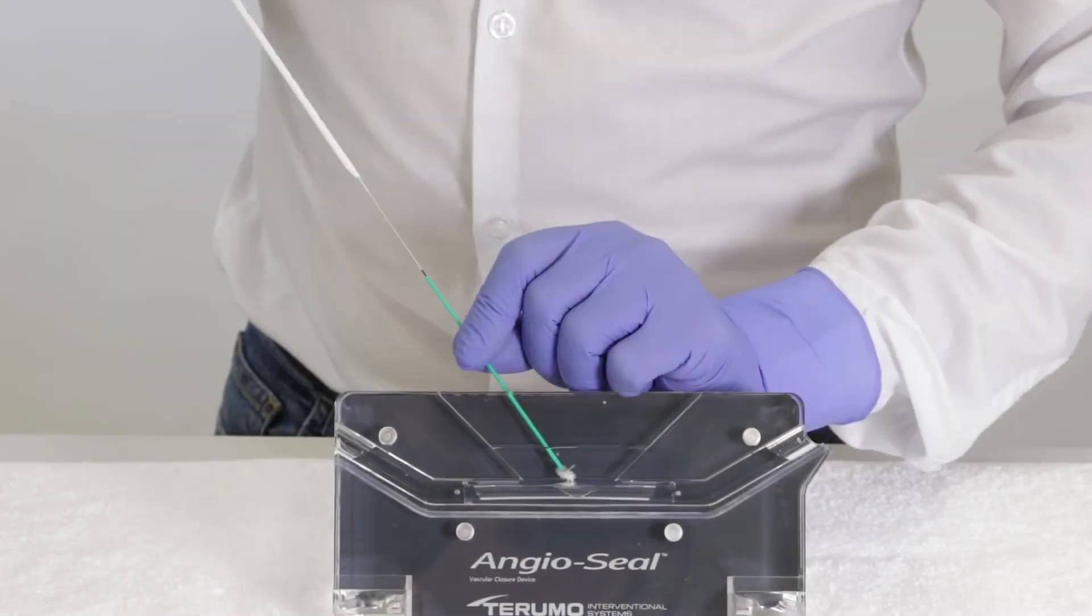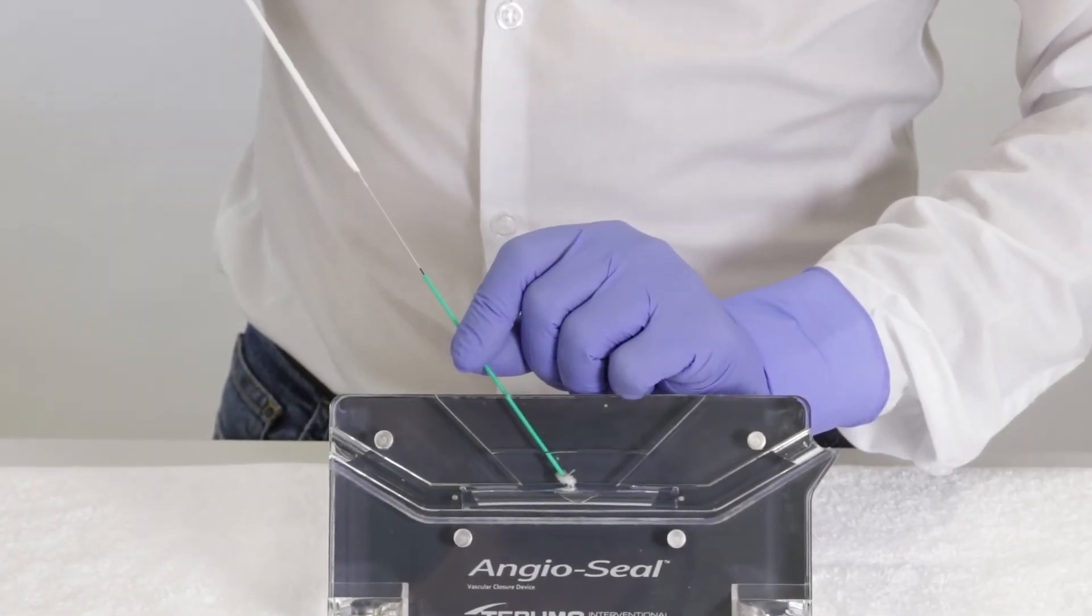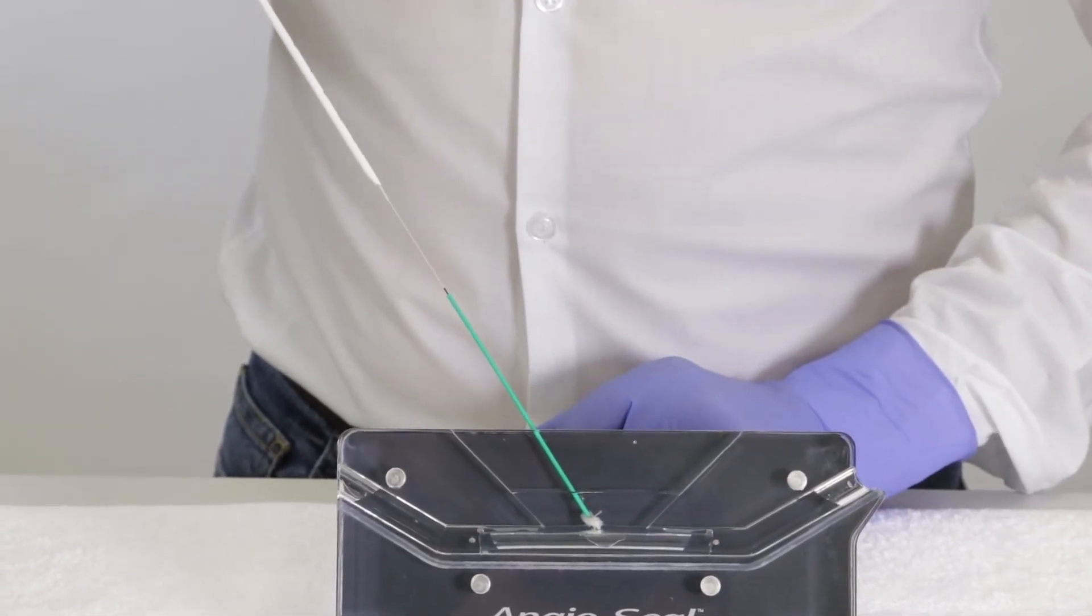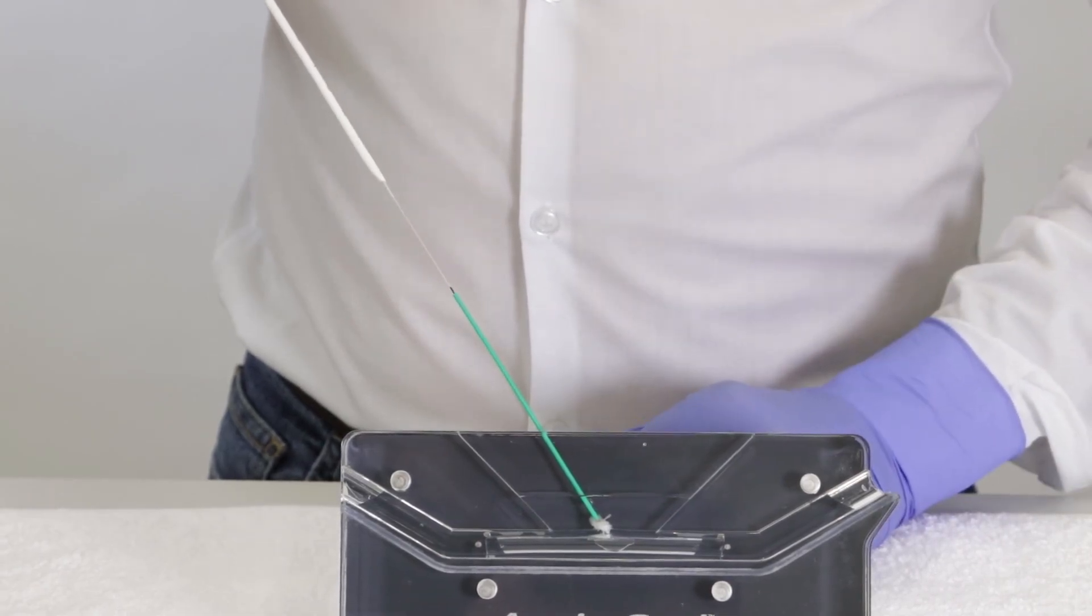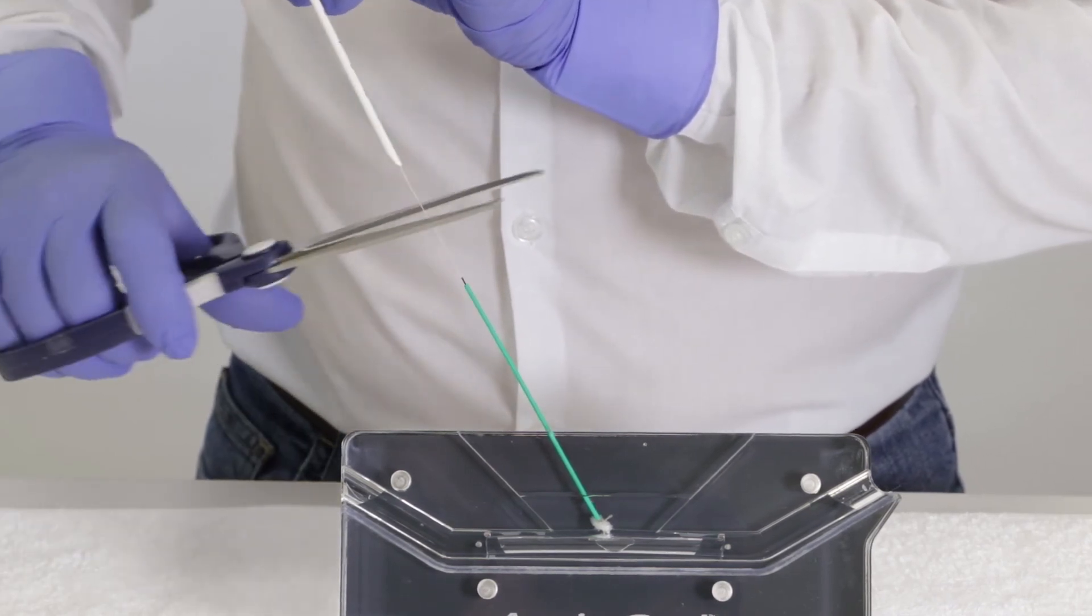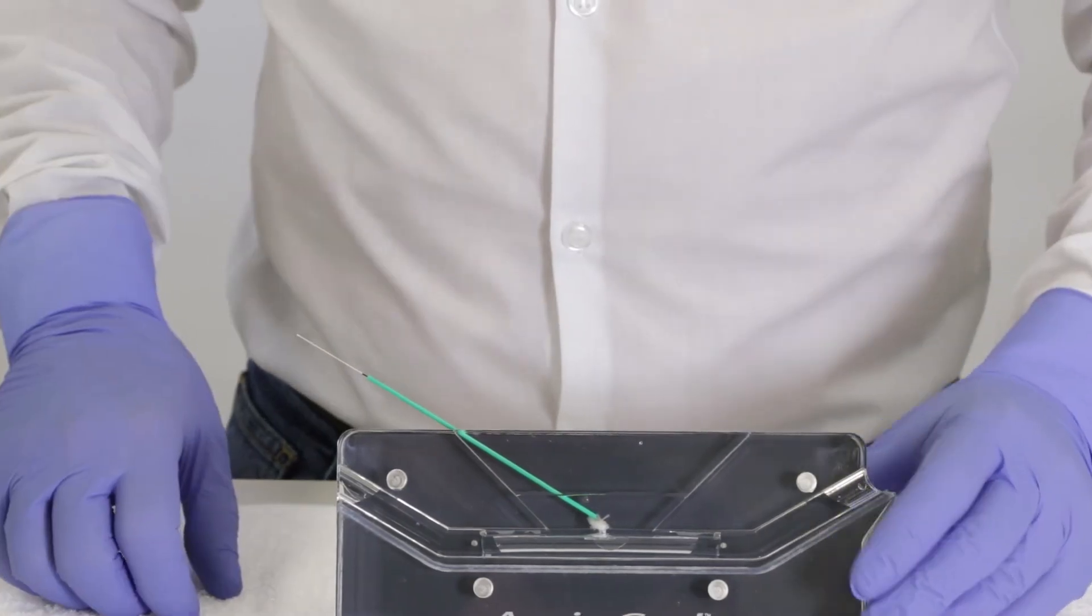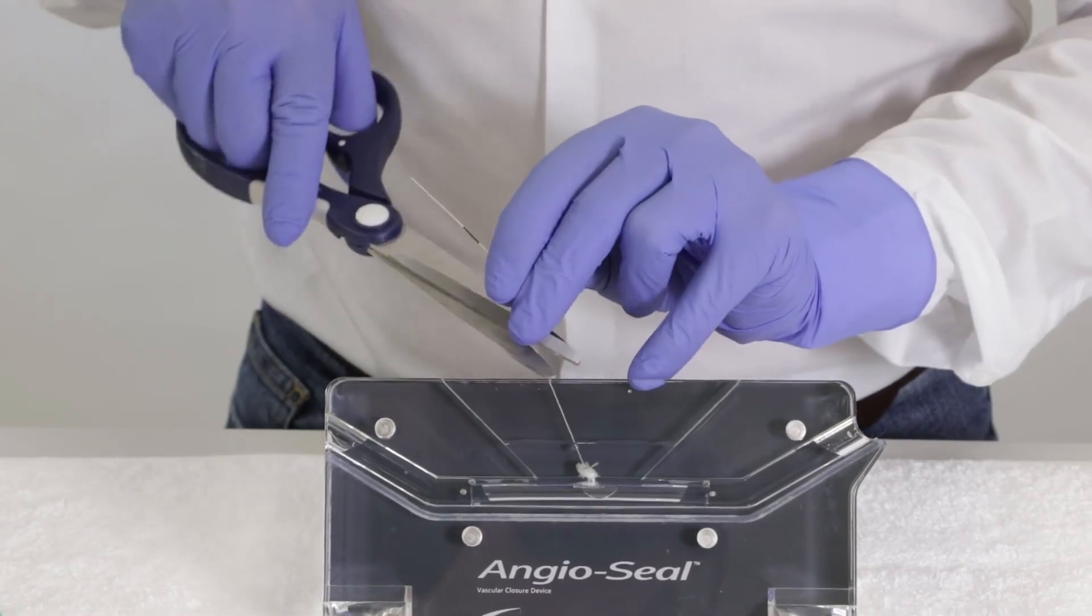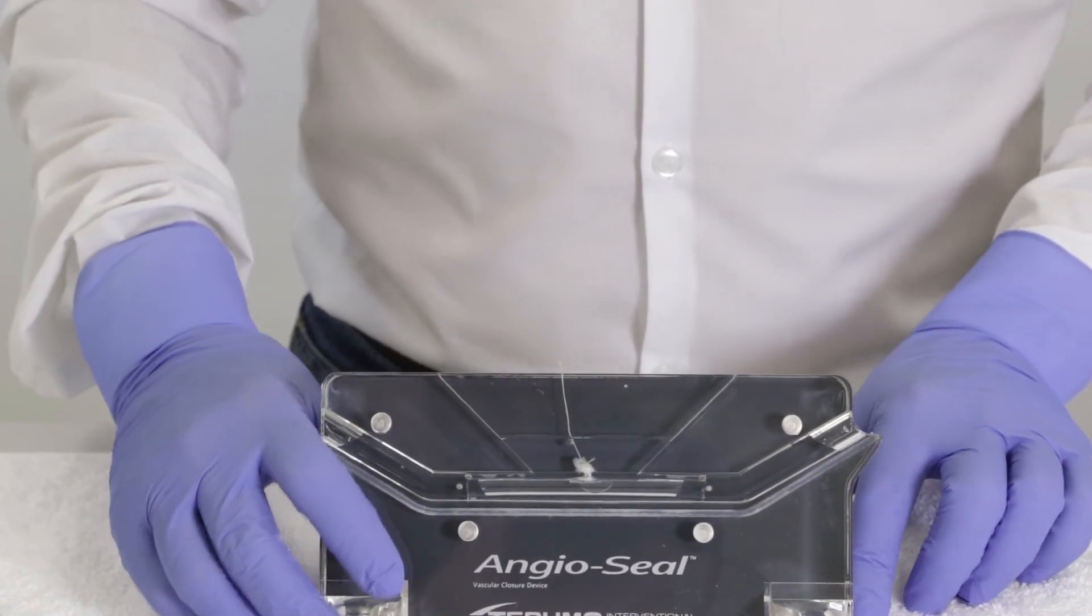Before cutting the suture, make sure there's no hematoma forming, no bleeding, because at this point you can still compress a little with the tamper tube. The first cut should be made between the black and clear markers. When all is okay, remove the tamper tube holding the suture, push down on the skin, and cut.